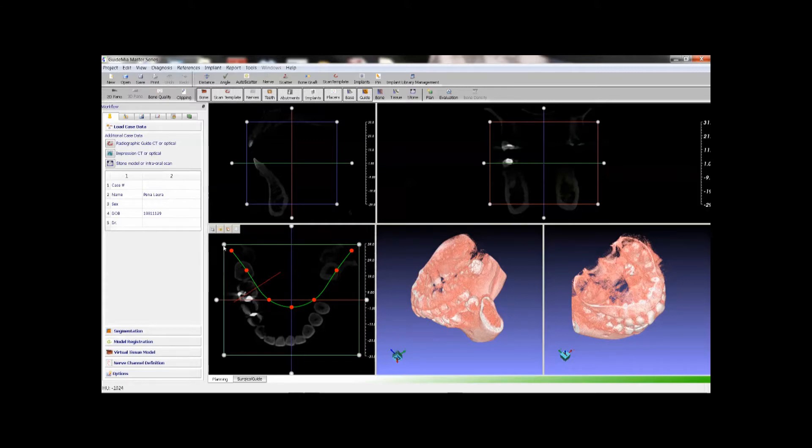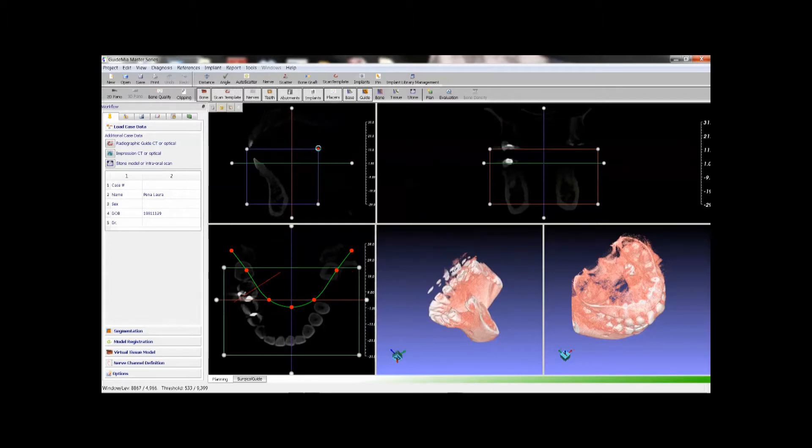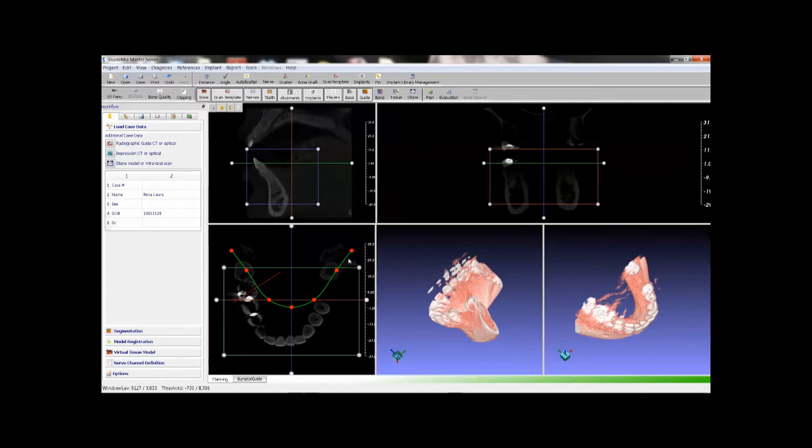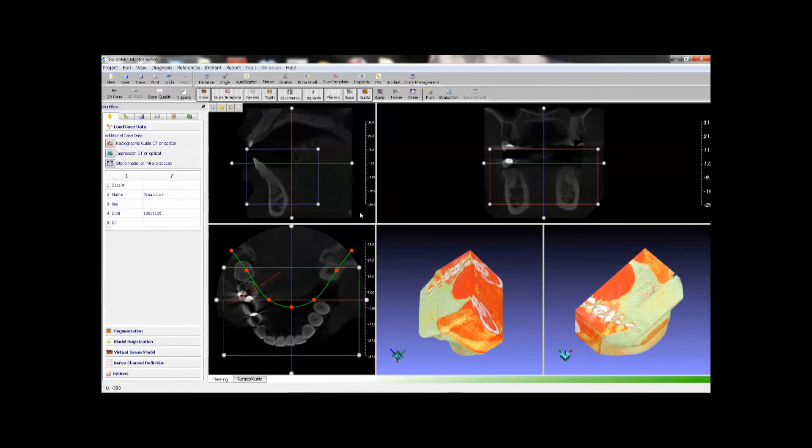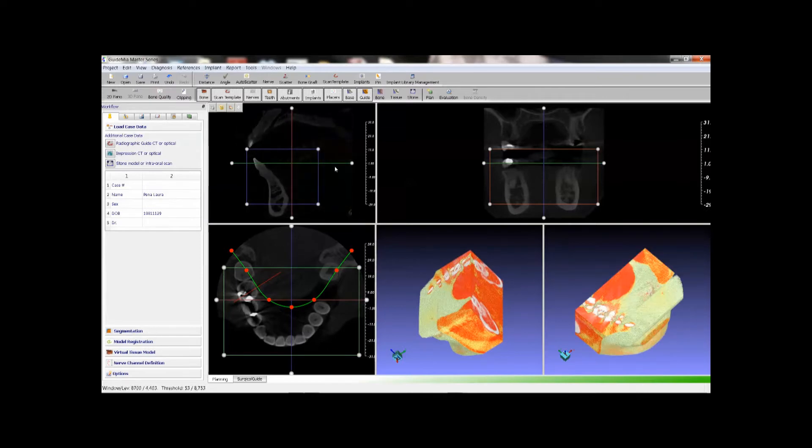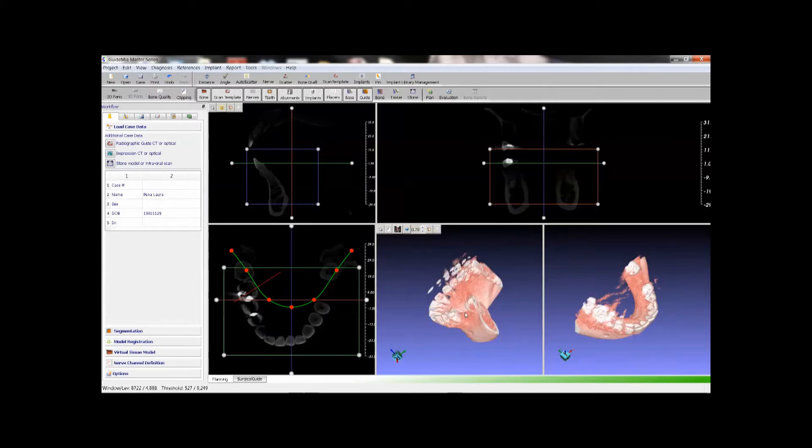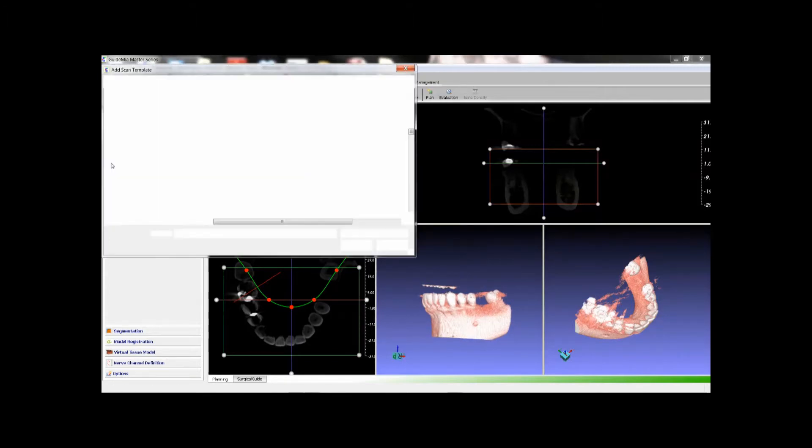We can drag the handles and cut the displayed area in 3D views. Adjust the threshold, or contrast and brightness, in 2D views. Notice the 3D will follow, and the threshold values are shown on the status message bar on the bottom of the window.